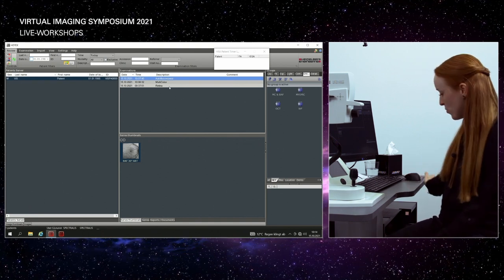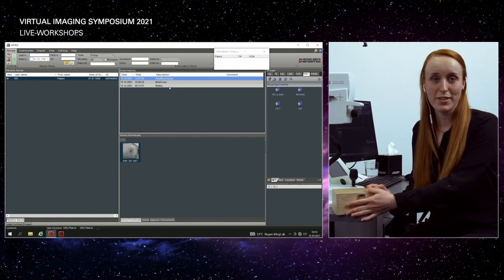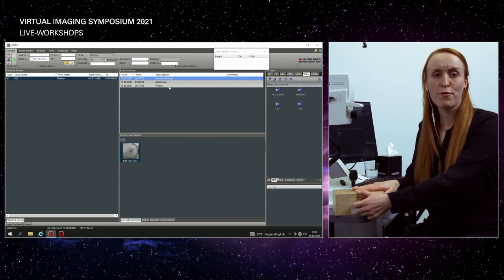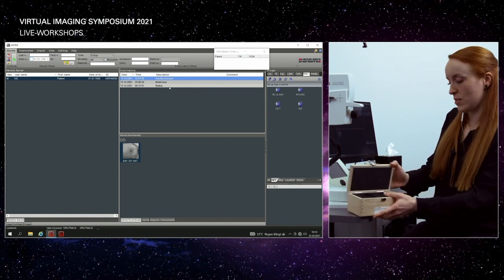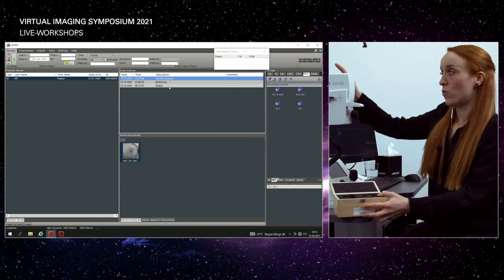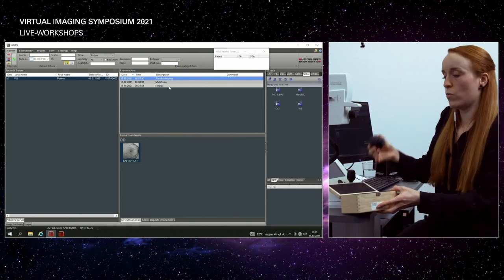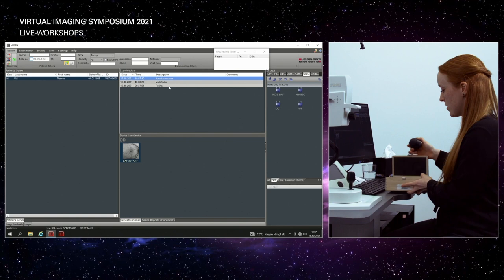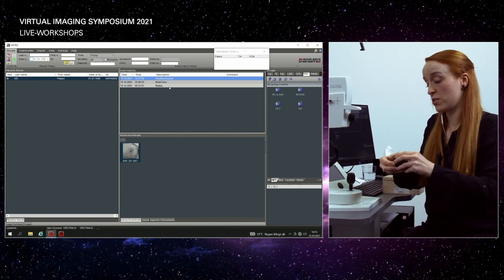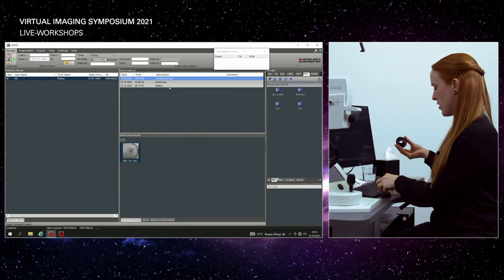I'd like to show you the wide field imaging possibility we have, and we'll do some 55 degree lens change now on the SPECTRALIS, okay? Right now we've had the 30 degree lens on the SPECTRALIS, and we want to have the 55 degree lens right there now. So it's protected by two covers, and I think you know how to change a lens.